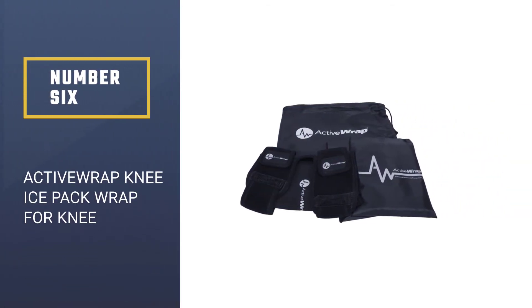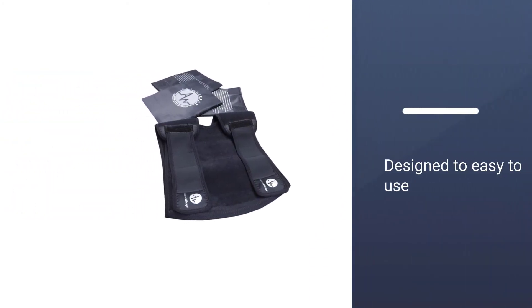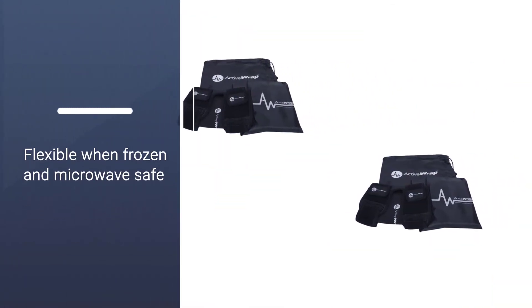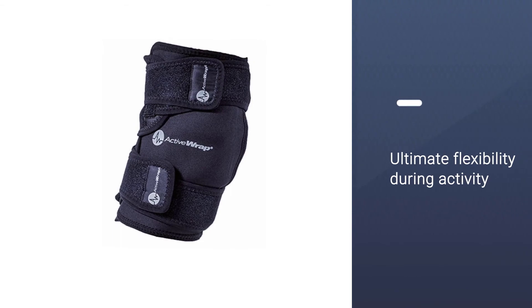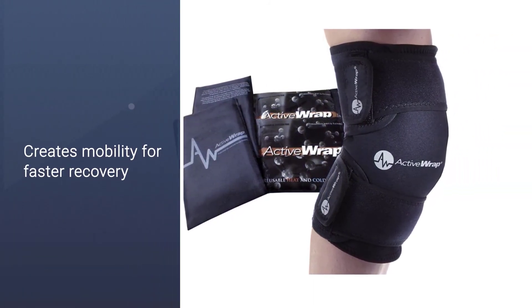Number six: Active Wrap Knee Ice Pack. Active Wrap is designed for professional use, providing hot and cold therapy after knee surgery. It is easy to use for both cold and hot therapy and is equipped with straps for customizing the experience. Flexible when frozen and microwave safe, the professional-grade support wrap ensures a proper fit and ultimate flexibility during activity. It creates mobility for faster recovery with the perfect combination of icing and heat compression, and the product is washable and reusable.